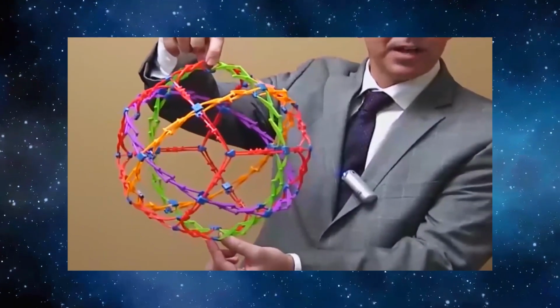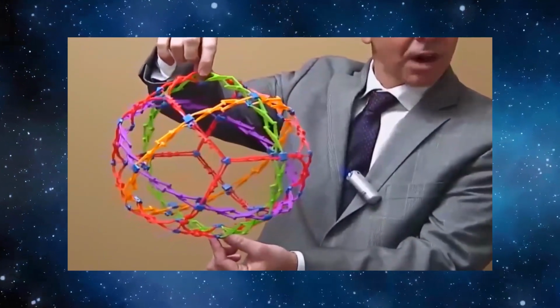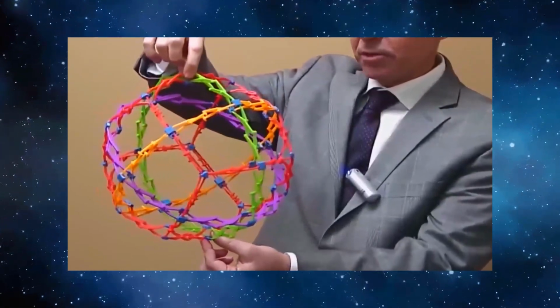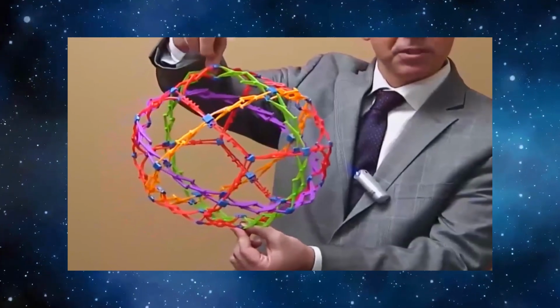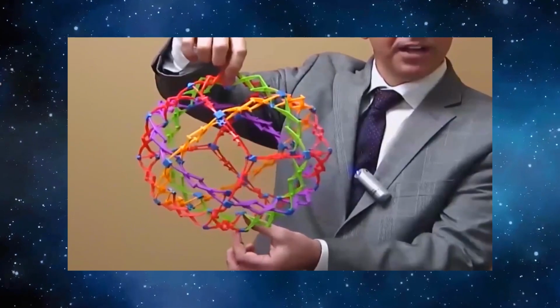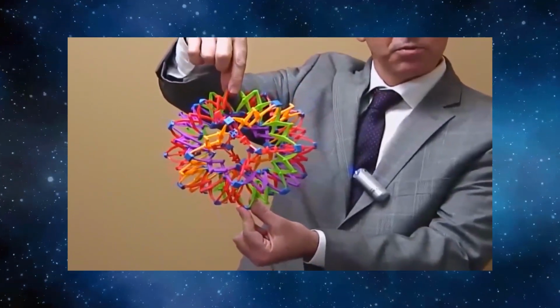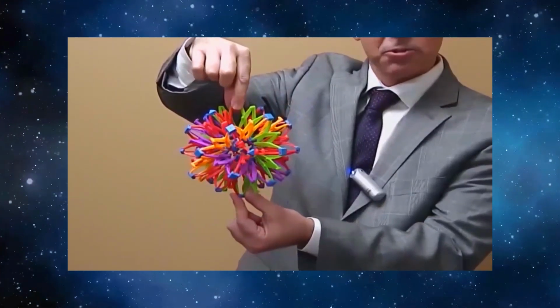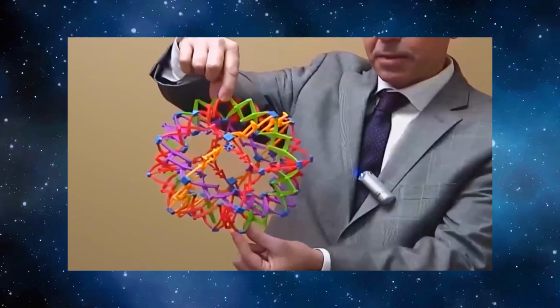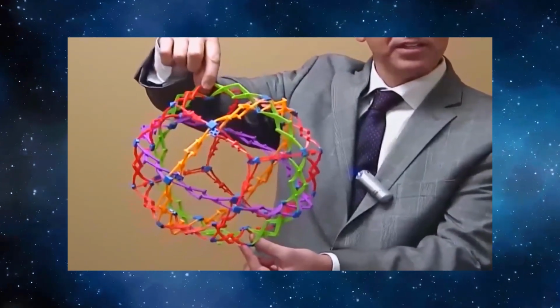And we're going to describe, using the nerdese that we just learned, that motion for the Hoberman sphere. So the first thing that we want to look at is the distance between this finger here I have on the Hoberman sphere and this finger here. And you see as we contract down, the Hoberman sphere gets shorter, right? The distance between those two fingers gets smaller. And as it expands back out, it gets taller. So how would we describe that in nerdese?